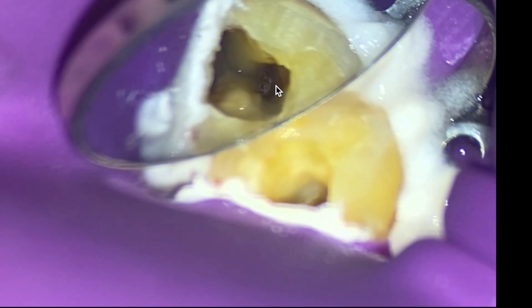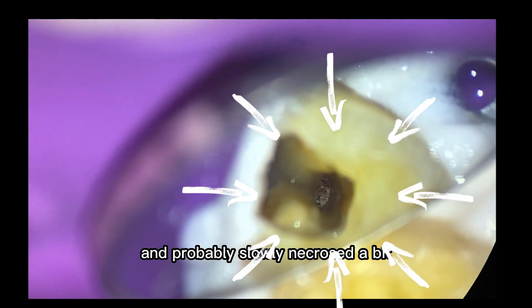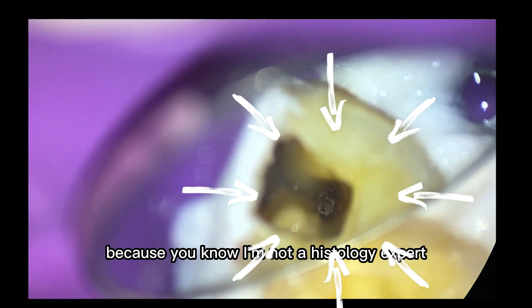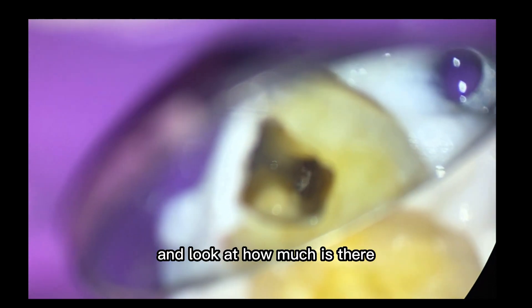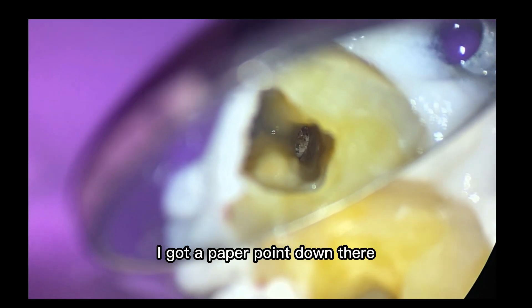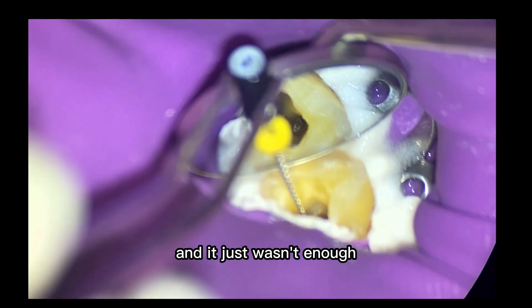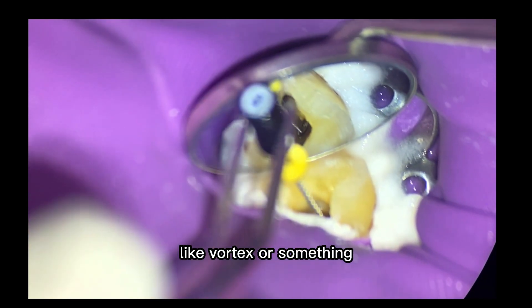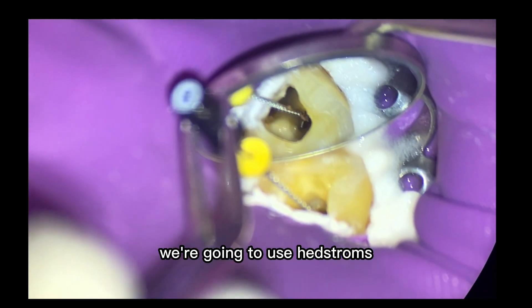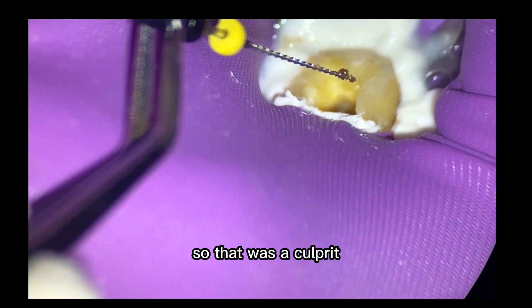So what is that? That is the pulp tissue that stopped hemorrhaging and probably slowly necrosed — this is probably some pulp tissue that's necrosed, and the hemorrhage has stopped. Look at how much is there — isn't that crazy? I got a paper point down there, got a gutta-percha point down there. I'd used a 40-04 and it just wasn't enough. So I wanted to use a Hedstrom file just to see how much material would come out. So there's our pulp tissue — that was the culprit.